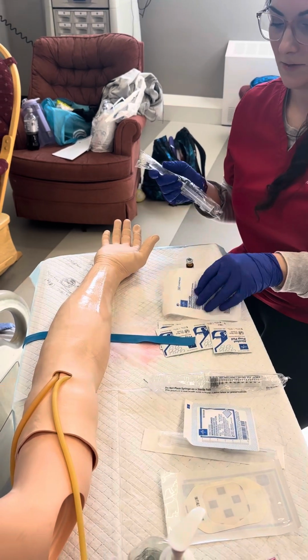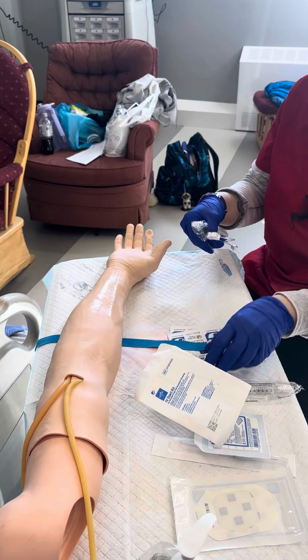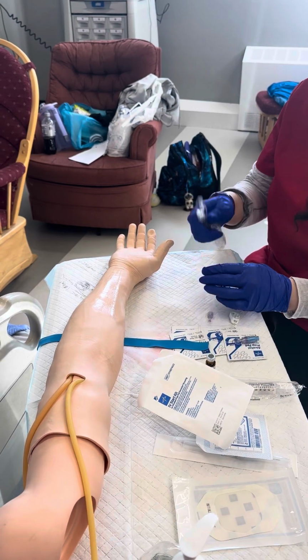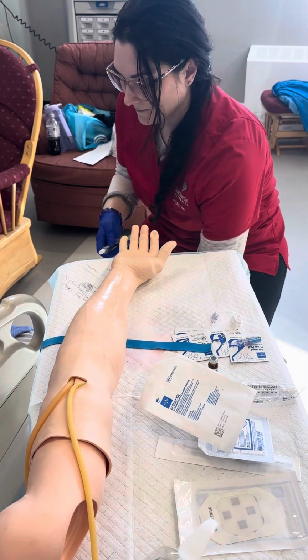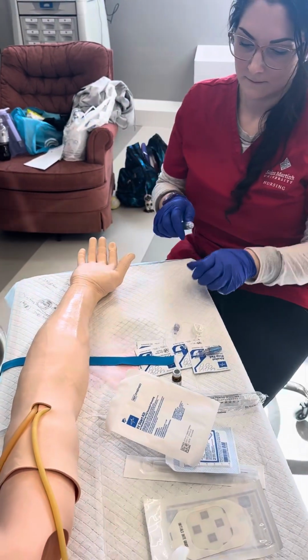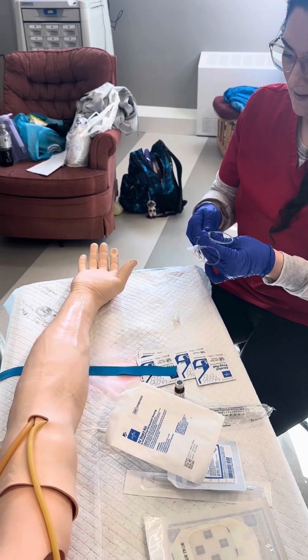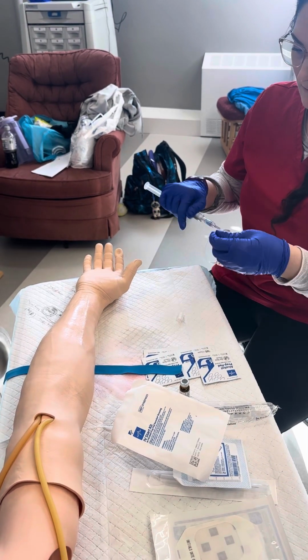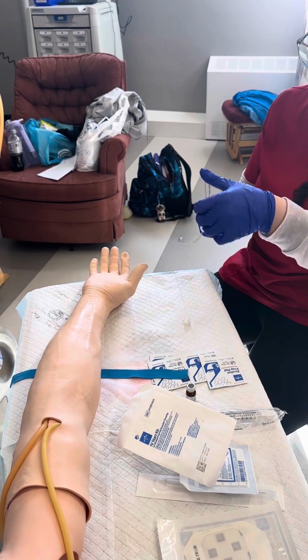I'm going to go ahead and prep this. All right, we're going to prep this line. Bubbles out.